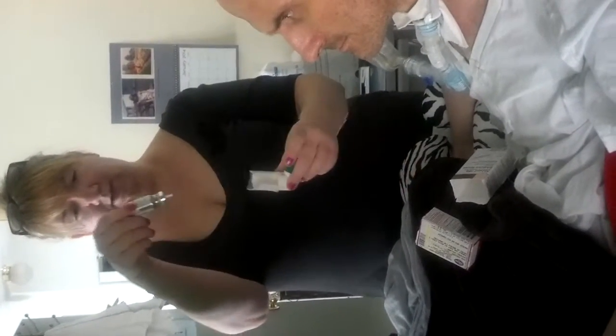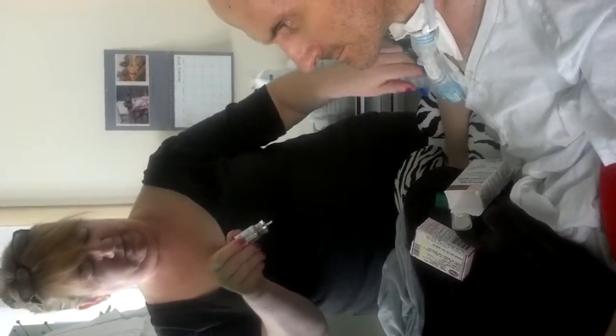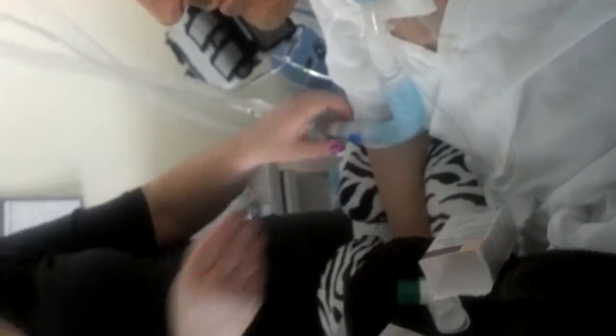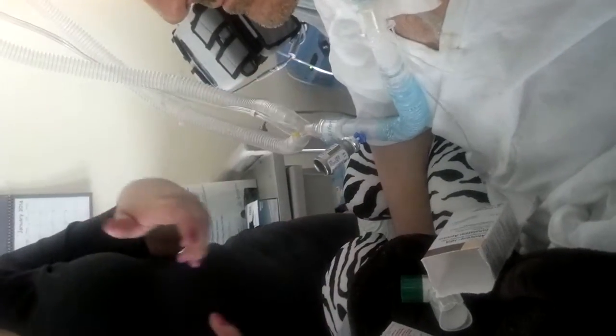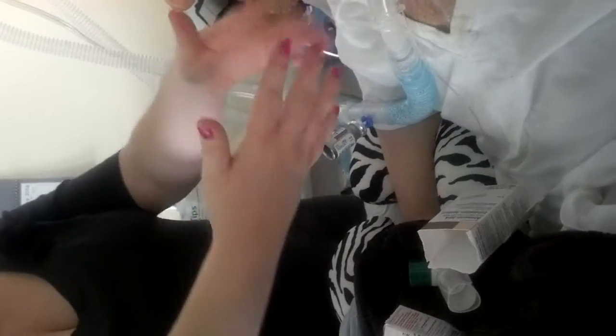So, this comes out. This has a little pen thing. This piece here — you pop it off. This fits in there, just like that. Notice you didn't lift this up. You left it right where it was, and you brought the medication to it. So you're not jiggling it everywhere.